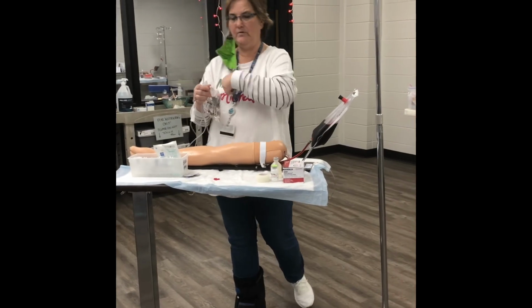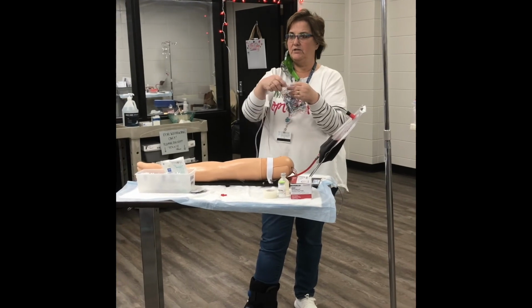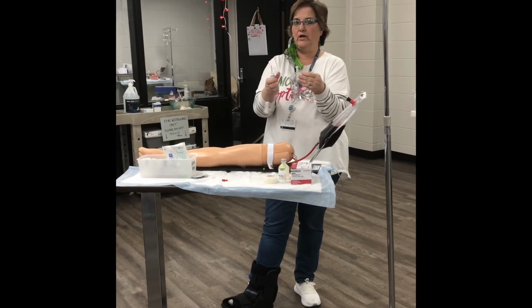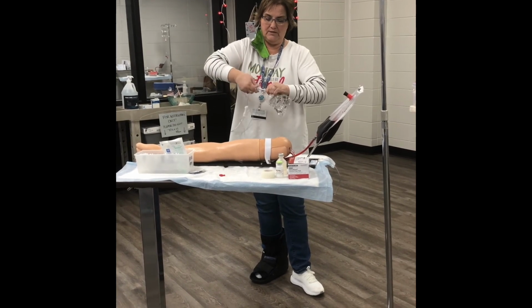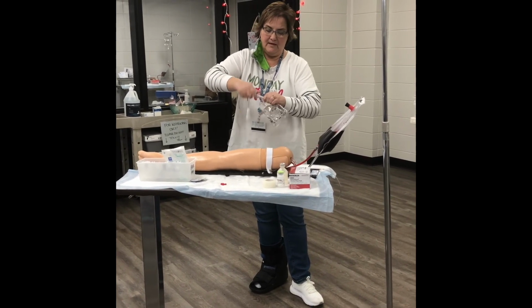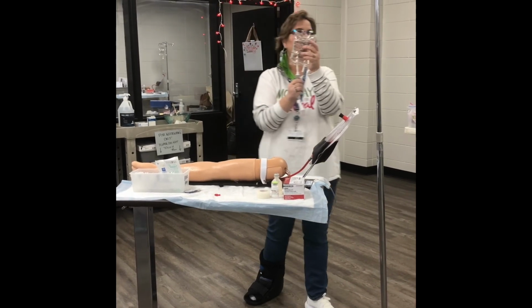Just like you did with putting syringes and needles together, this can't touch anywhere. This is all dirty and this is going in my vein, so just be careful. And then if you will push and turn at the same time, put it all the way down to there's a little notch there. Squeeze it.